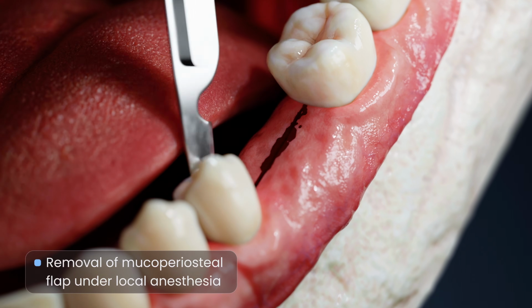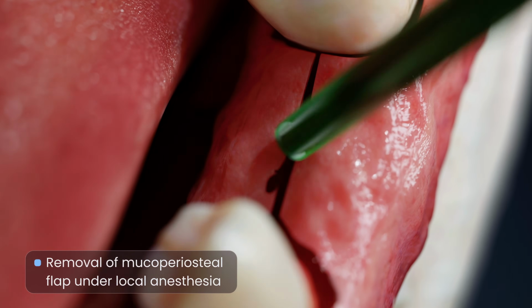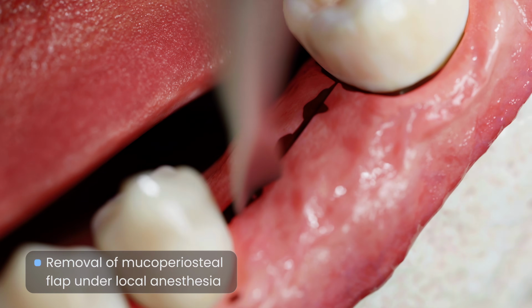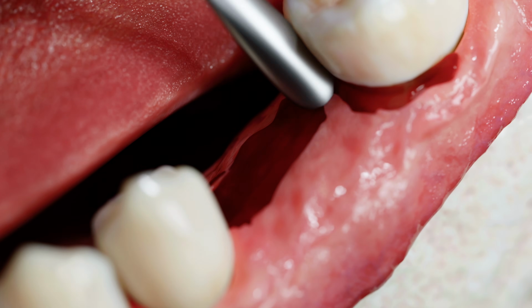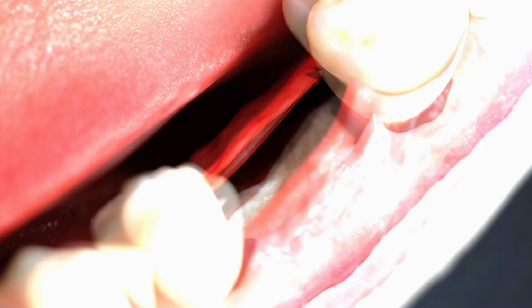Using a scalpel, an incision is made along the center of the alveolar process in the area of the missing tooth and an intrasulcular incision extending to the midpoint of the crowns of adjacent teeth. A periosteal elevator is used to dissect a full-thickness mucoperiosteal flap in the same area.